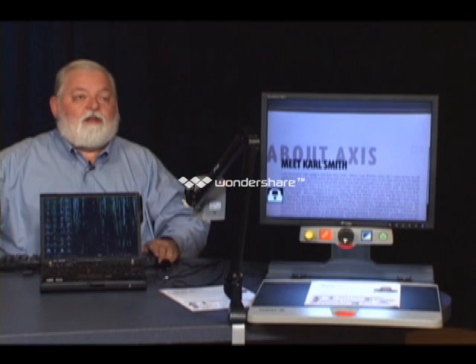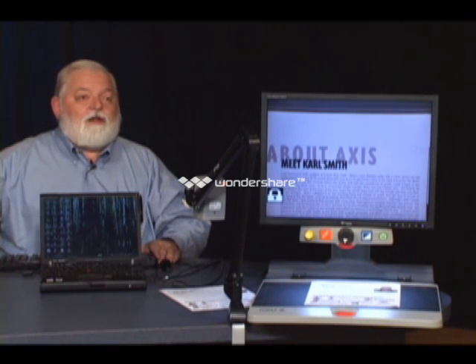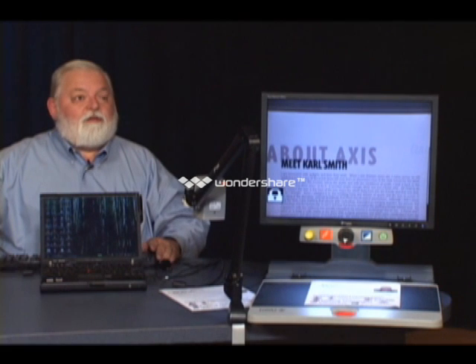When people get to that point, and we'll talk about that a little bit today too, you usually think of it the other way, but there comes a time when it is time to look at other options besides low vision. And some people have a really difficult time with that because nobody wants to give that up. But at this point, I don't know of any other way. If it really needs to be that small, the only thing they can do, of course, is hold it further away, and if their vision is pretty good in that little field, maybe they can read it. But it may be an issue if it's too small for them to read and magnification doesn't help. You may need to have them use speech or Braille.